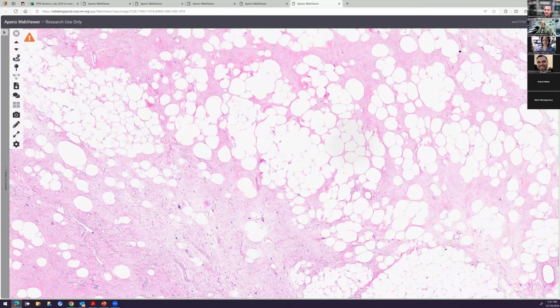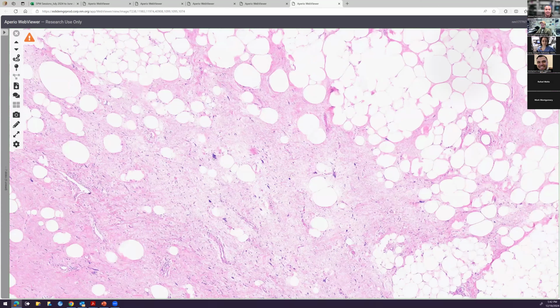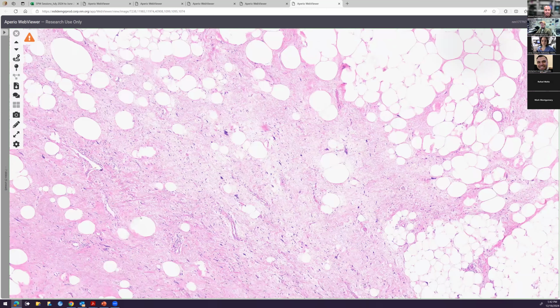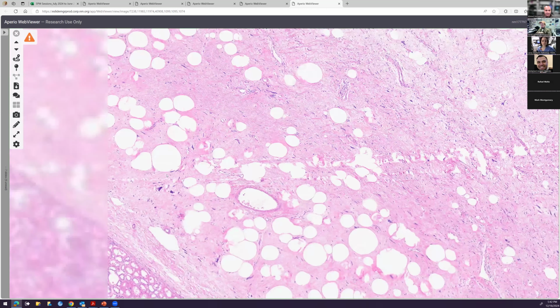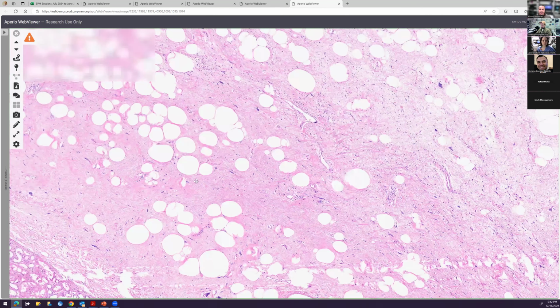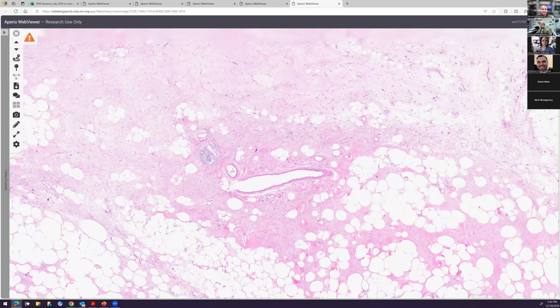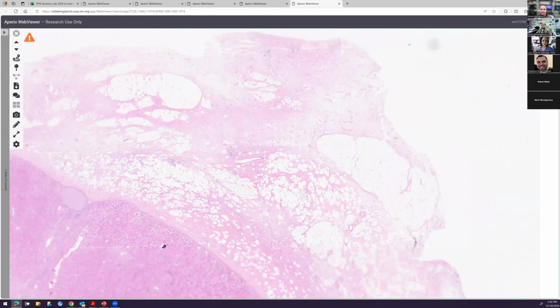But then in these sclerotic bands, you're seeing large amounts of these scattered hyperchromatic atypical cells. Now you just see them out and about, scattered about, not really forming a large tumor mass with a whole bunch of pleomorphic cells all together. Usually you'll just see them like this. Okay. Anything else to talk about with this one? Now, basically, this is just showing you a good example of one in the retroperitoneum. Very typical location.